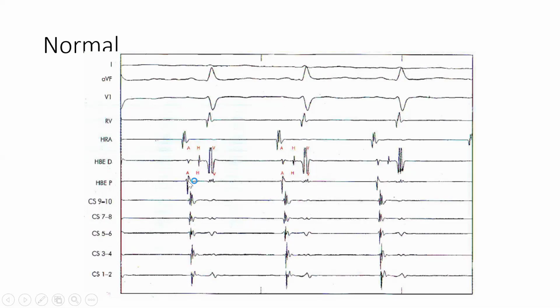So you can say there's a faster conduction or early activation there compared to the other sides. We will see further when we start looking at the Braunwald MCQs. We'll see how to make those diagnoses. But this is the baseline that will help you tease out where the diagnosis of the problem is.